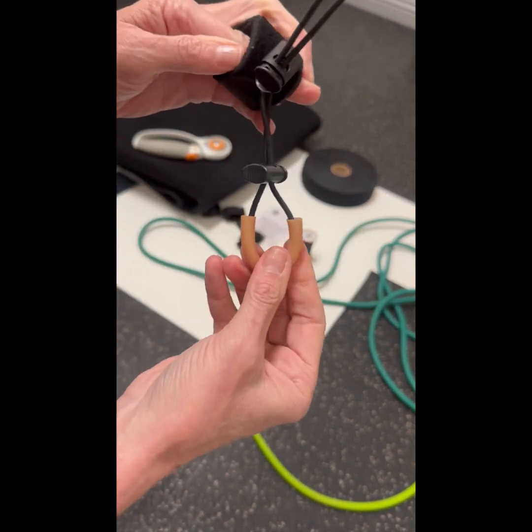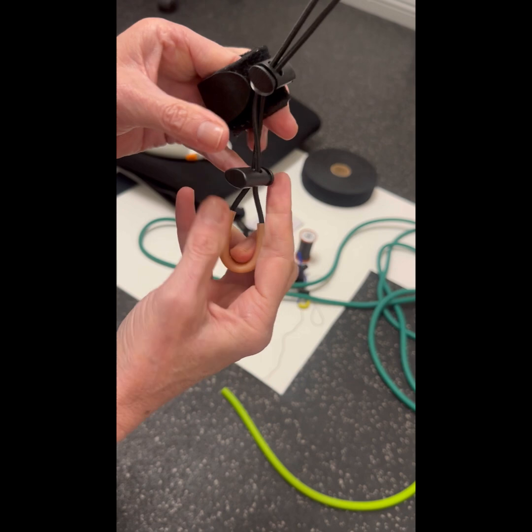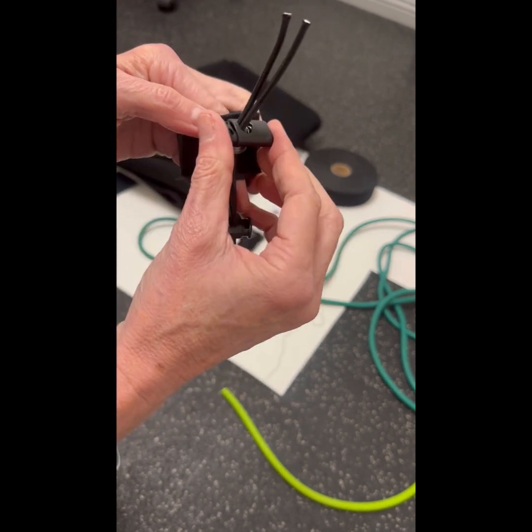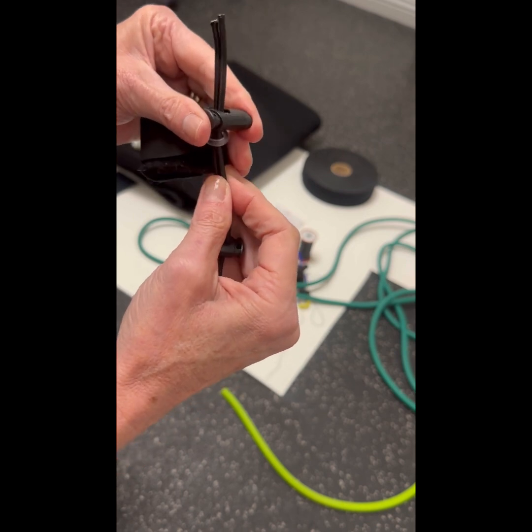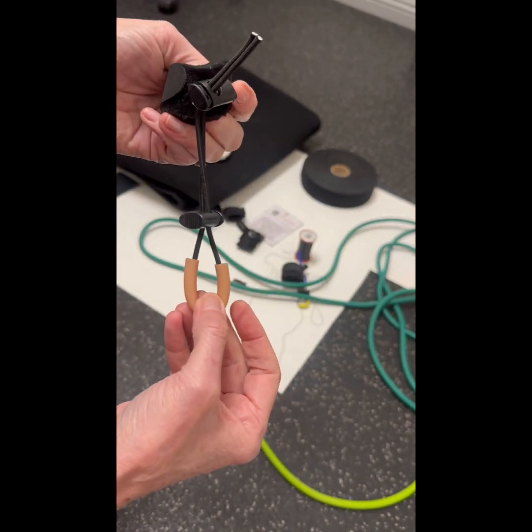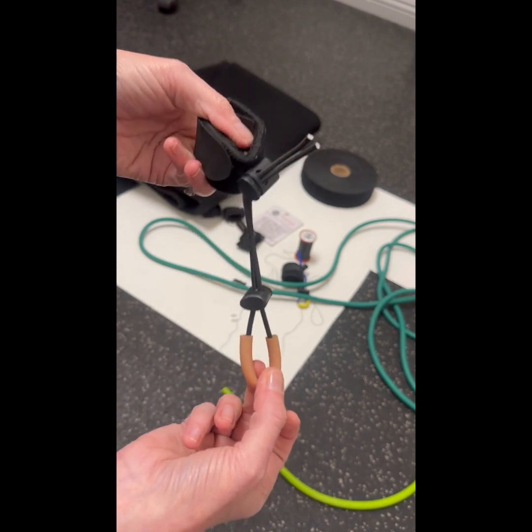That way you have one cord lock that's going to effectively keep it in the loop and keep it around the toes. And then you'll have another cord lock up on top that will help give you the tension that you need to keep the toes up.